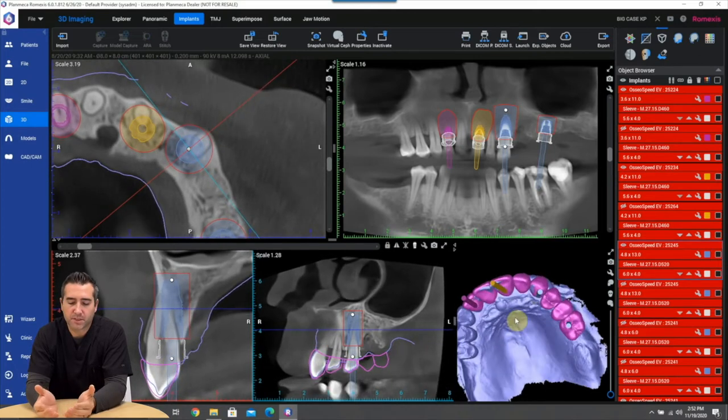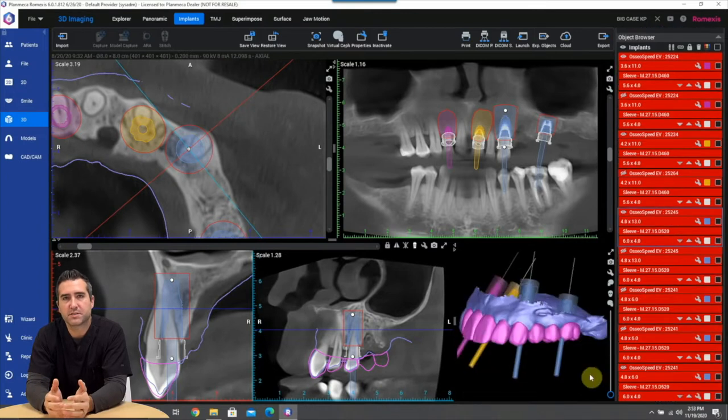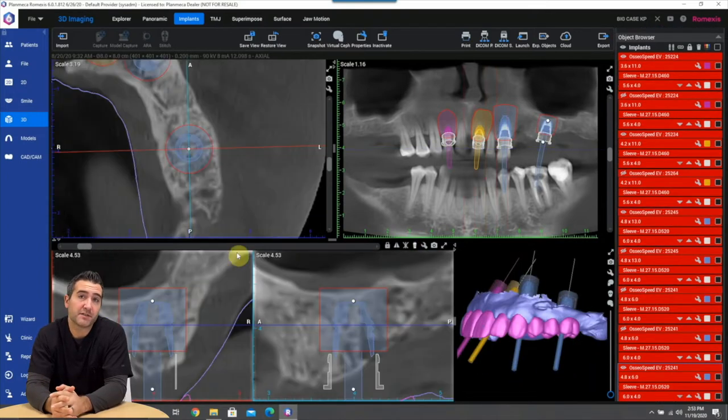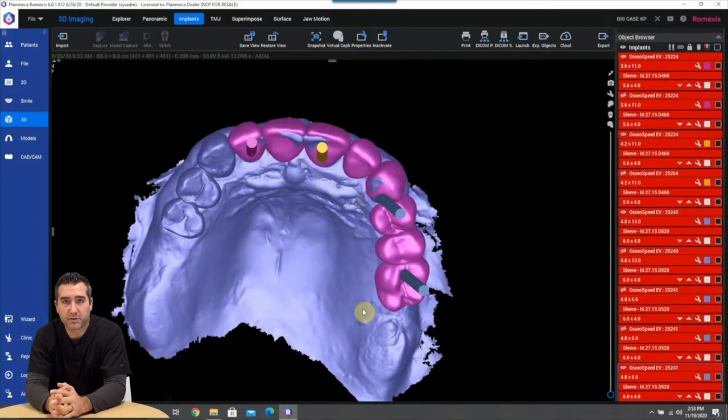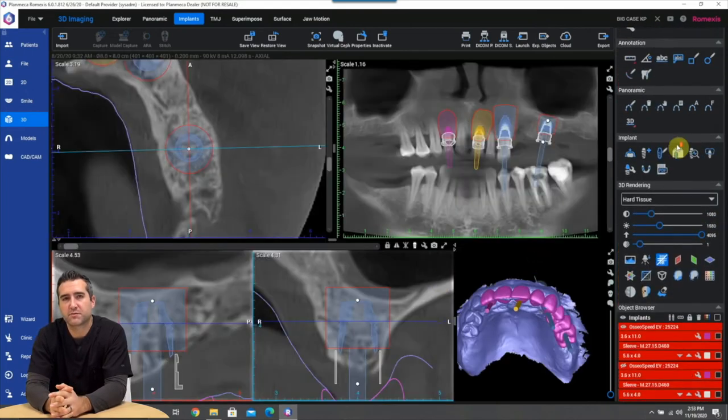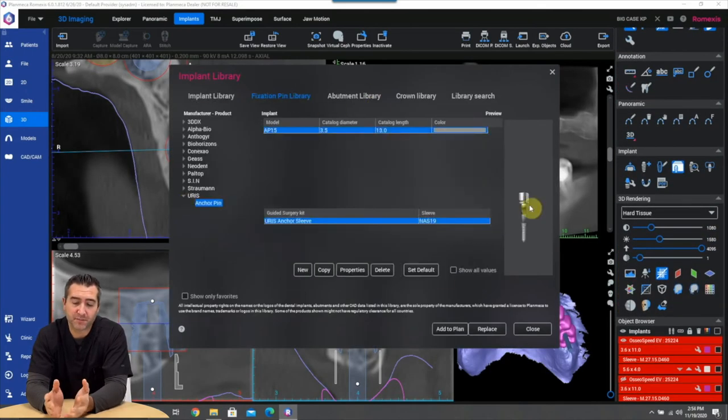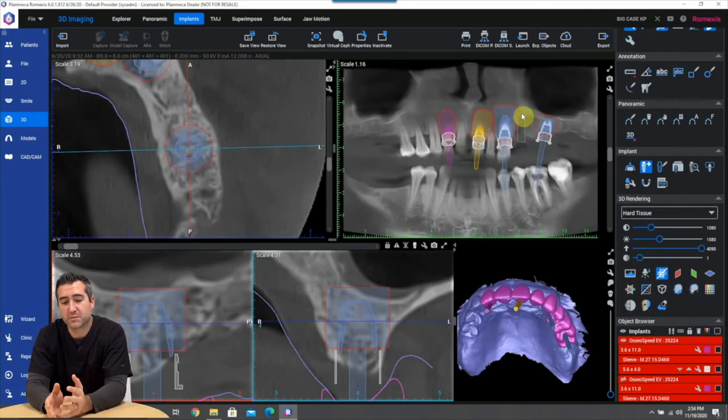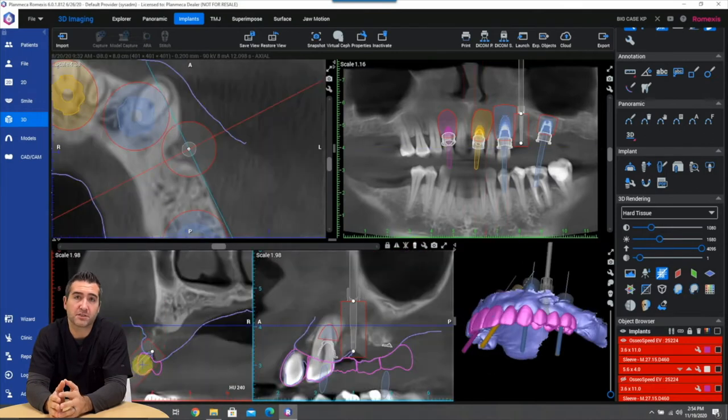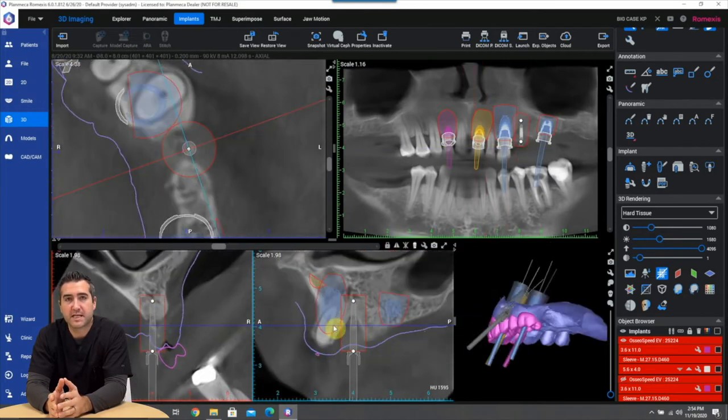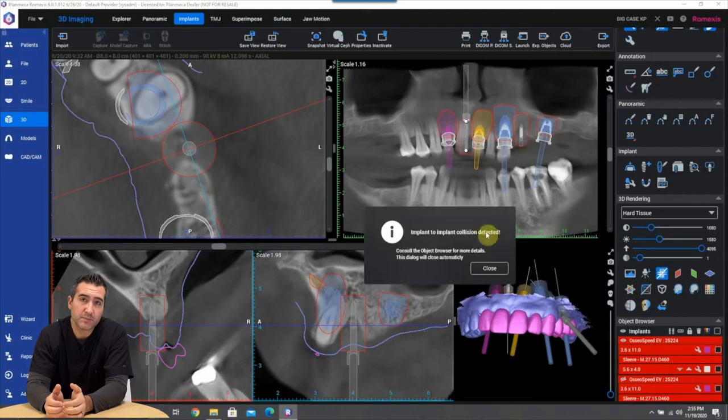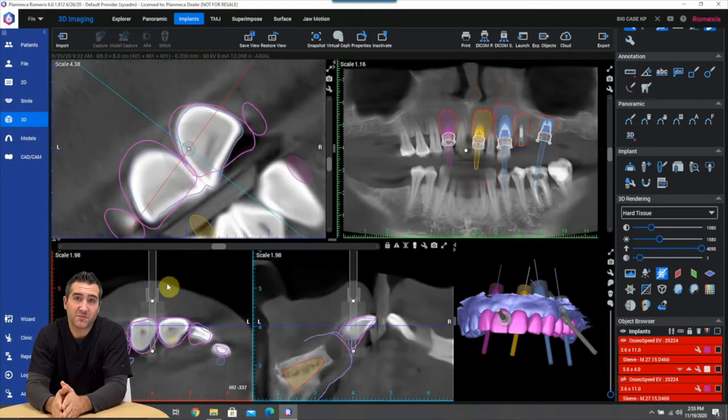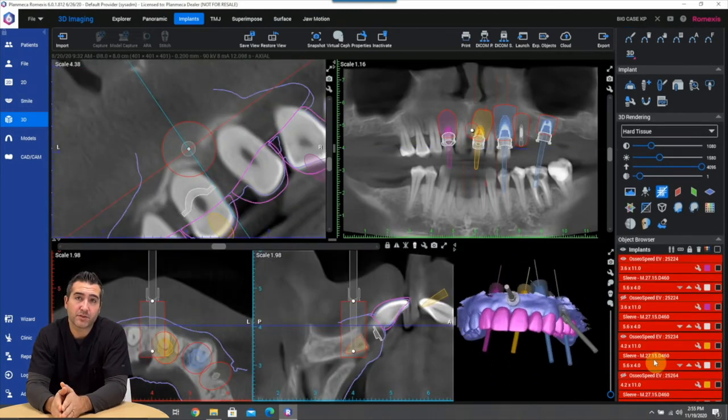We're going to use the location angulation and depth of about three millimeters apical to the facial CEJ of the diagnostic wax up and about two millimeters palatal. And of course this depends on what kind of implant you're using. If it's a platform switched implant with the internal conical connection with a Morse taper you're more likely to place it deep.